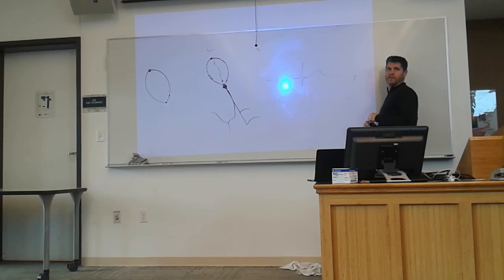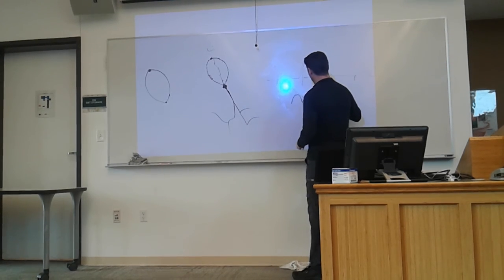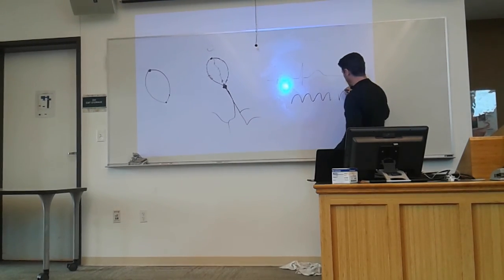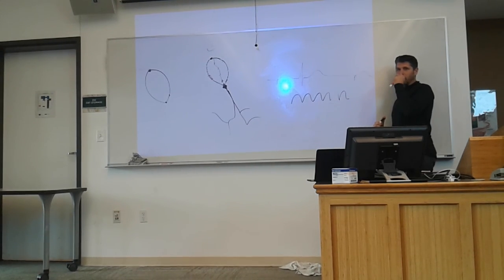Okay? So what we end up getting is P waves, right, that happen over and over and over again without any sort of delay, without any sort of pausing in between, without any sort of baseline. Does that make sense? Mm-hmm. Questions?